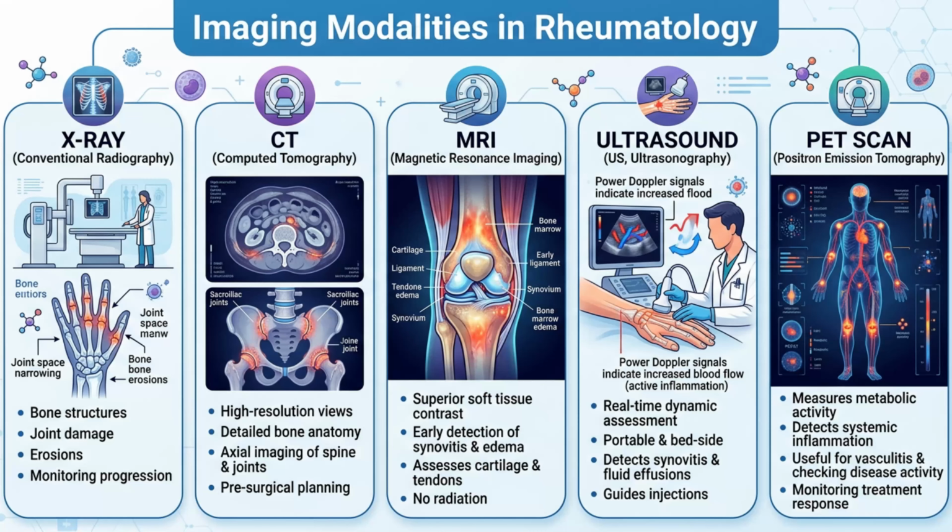So today we will be discussing the imaging modalities that are used in the diagnosis of various rheumatological diseases. Okay, so coming to the oldest and the commonest imaging modality that we use, it is your X-rays.